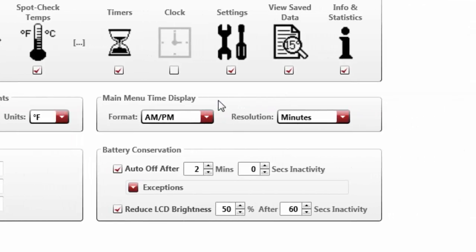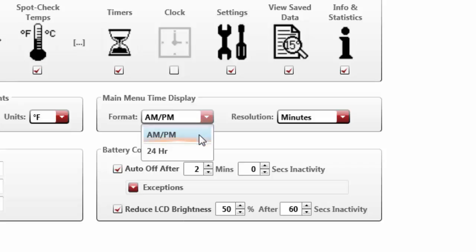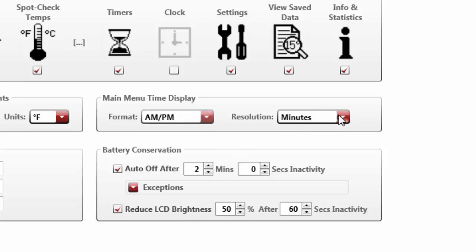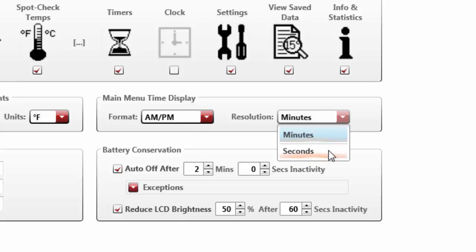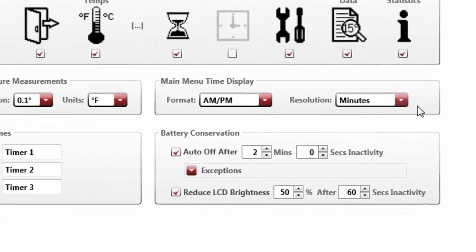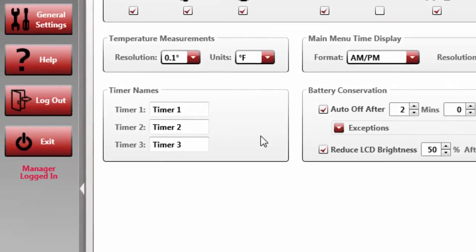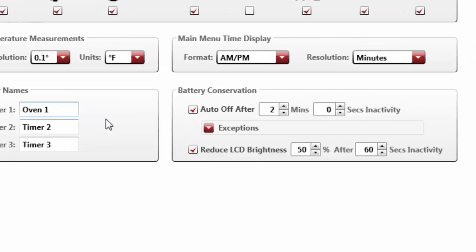Just to the right of this area are the date and time display options for the handheld unit. Simply toggle your choice of how you would like your date and time formats to read on the device and click Save Changes to continue. The display names of the three timers housed within the Timers application can be customized by clicking your mouse inside of the associated text boxes and typing in your new selection.